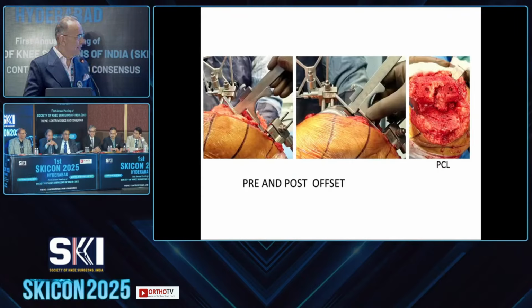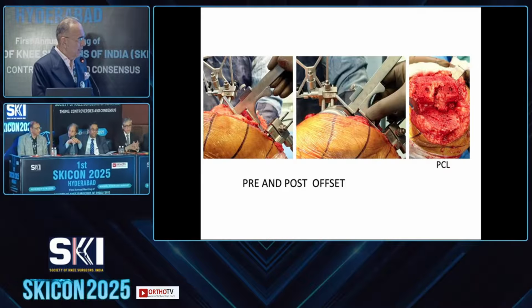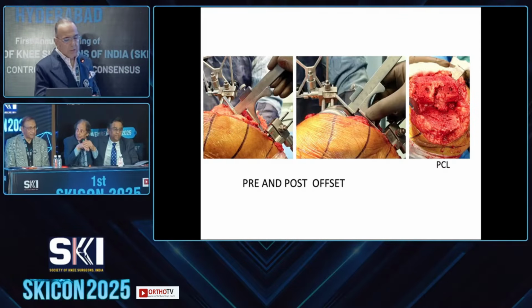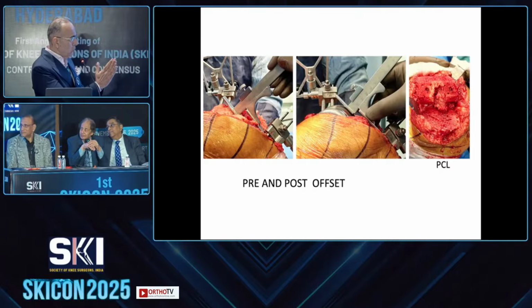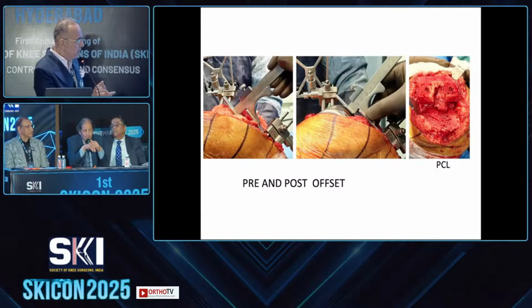But the majority of times we've gone to one of the iterations of the CR/medial congruent/medial pivot. Right. So, sir, you see a PCL on the table. How do you know that it is functionally intact? Anatomically, it may look intact, but what are the measures or signs to tell you that it's functionally intact?